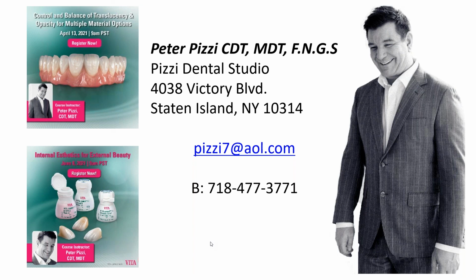if I can't find an exact match with a tab, what do I use in the photo to recommend the closest reference? So you'll never find an exact match. You're always going to find a reference, and sometimes you may need more than one reference. Like the pictures that I showed of those teeth that had 6 different colors in them, maybe you need 5 shade references. Maybe you need the cervical of the 2M3 and the incisal of the 1M1. You might need a few different ones.